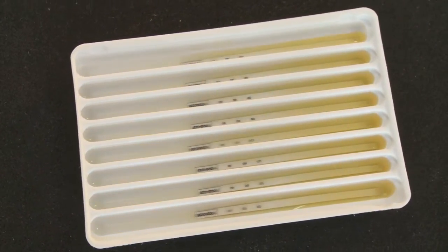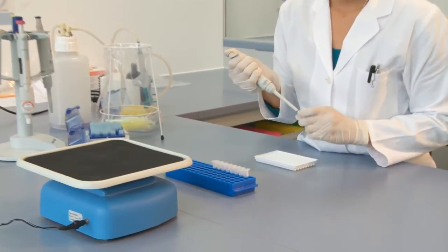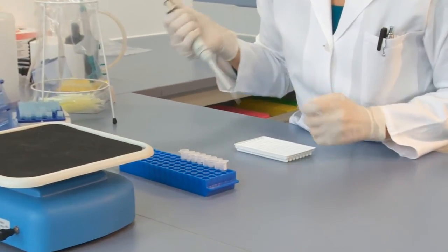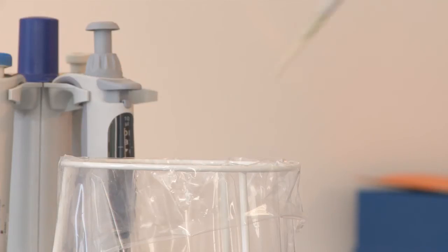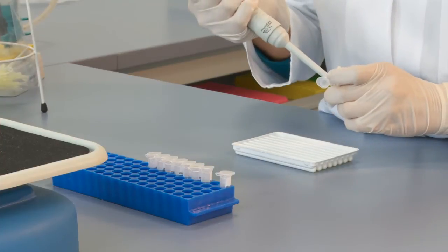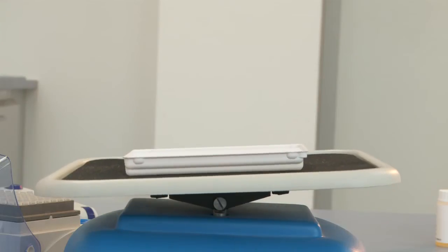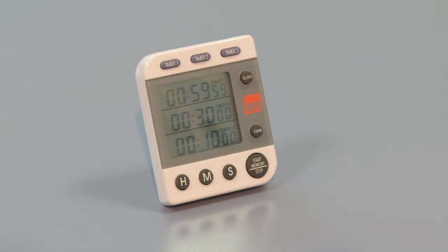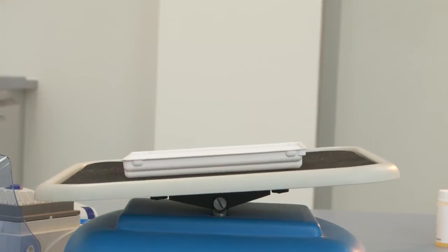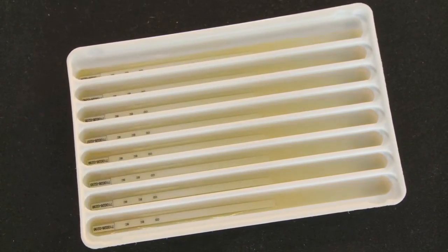Once the blot strips are evenly moistened with sample buffer, 10 microlitres of the patient sample are pipetted directly into the appropriate compartment of the tray. To avoid cross-contamination, each sample must be pipetted with a fresh pipette tip. The strips with the samples are then incubated for 60 minutes at room temperature on the rocking platform. This incubation period allows any autoantibodies present in the serum sample to bind to the corresponding antigens on the immunoblot strip.